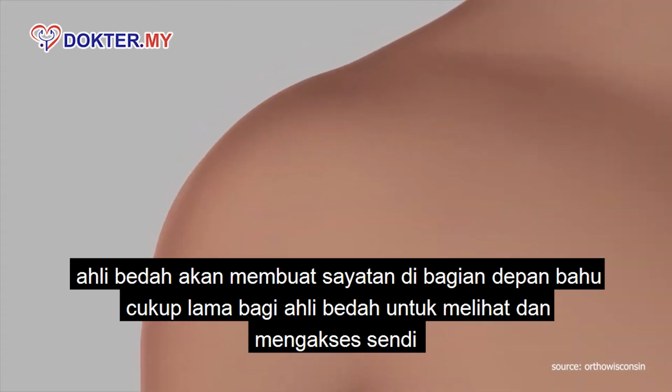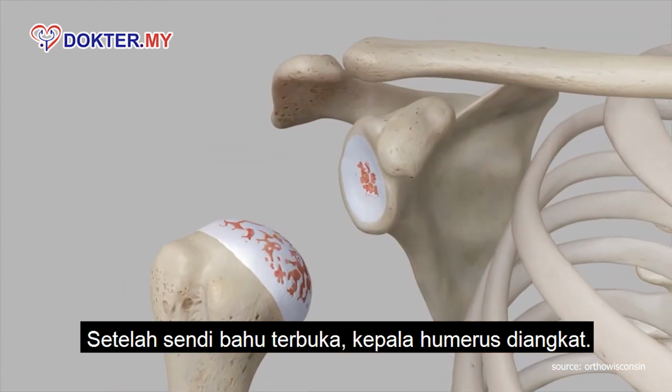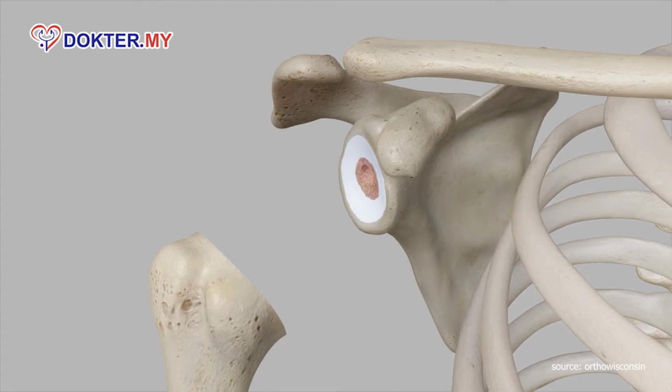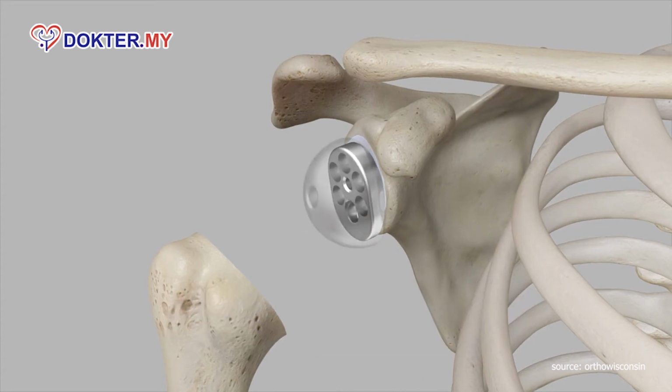The surgeon will make an incision in the front of the shoulder, long enough for the surgeon to see and access the joint. Once the shoulder joint is exposed, the head of the humerus is removed. Next, the socket, glenoid, is cleaned out and prepared for the implant. A glenoid plate is inserted to act as a base for the metal ball, glenosphere.